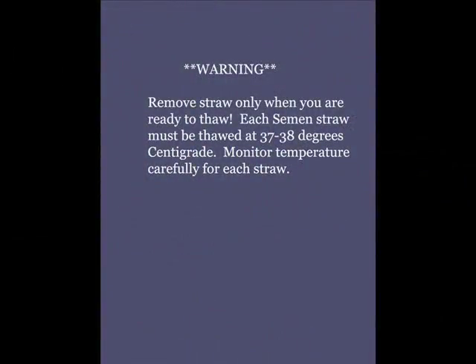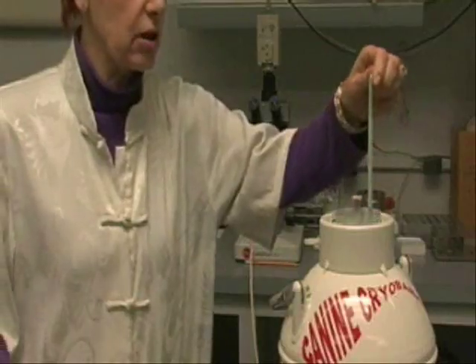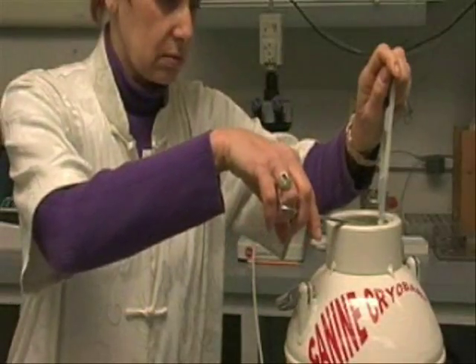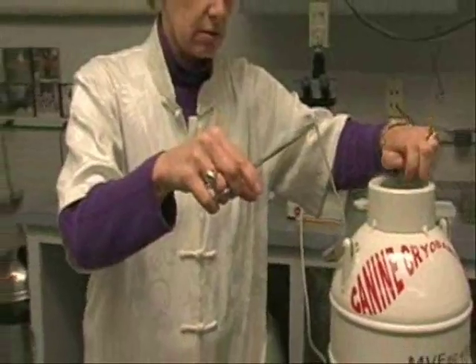Warning! Remove straw only when you are ready to thaw. Each semen straw must be thawed at 37 to 38 degrees centigrade. Monitor temperature carefully for each straw. Use tweezers or hemostats to hold straw at the tip of the open end.